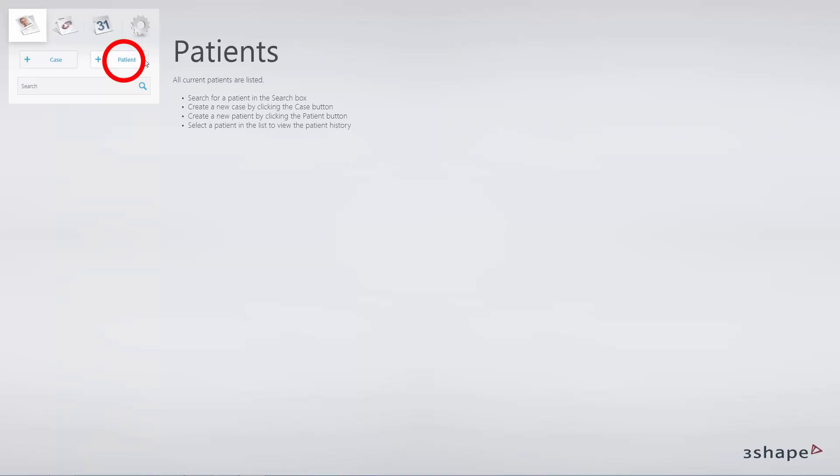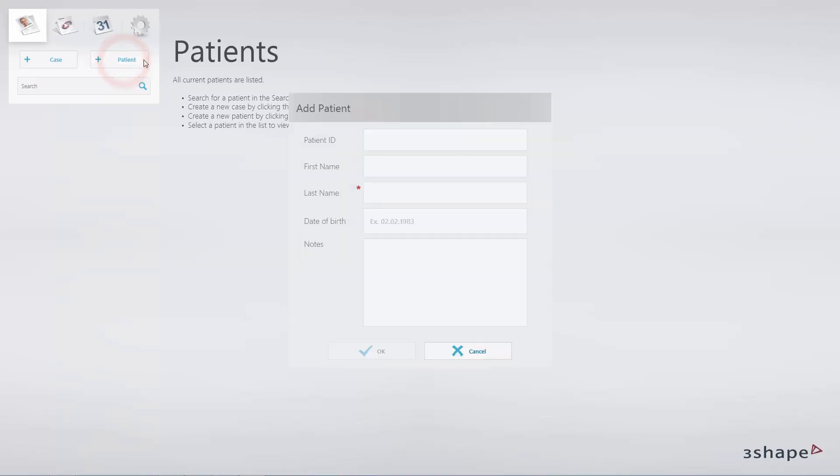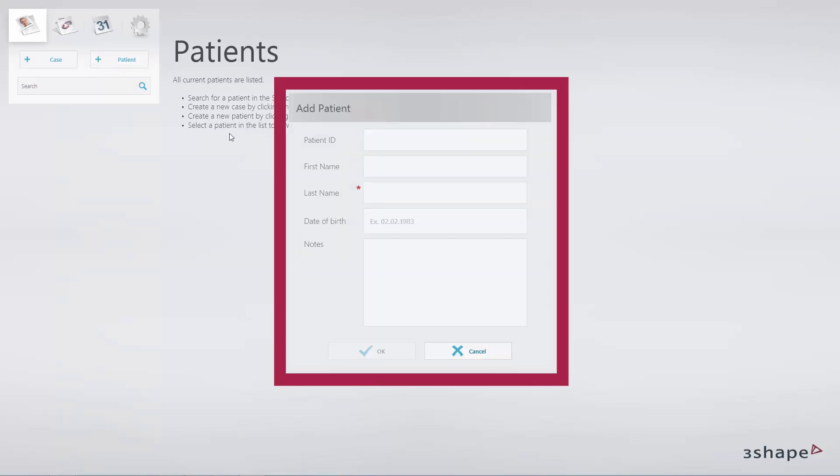To create a new patient, click the Patient button. Fill out the required fields and click OK.